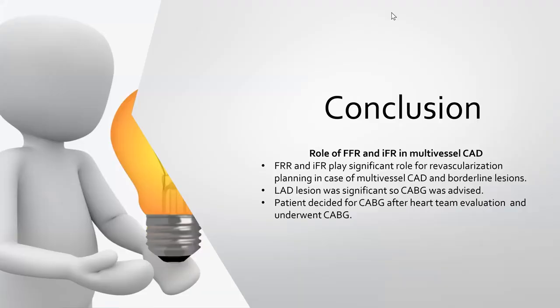So that patient was actually advised CABG based on this, and the patient decided for CABG after heart team evaluation, and he underwent CABG successfully. So IVUS, FFR and iFR play a significant role for revascularization planning in case of multivessel CAD and borderline lesions.